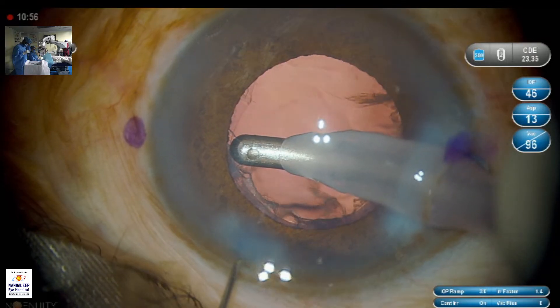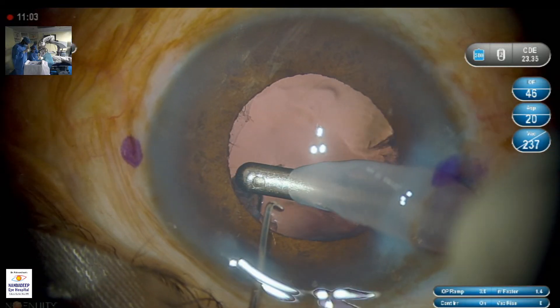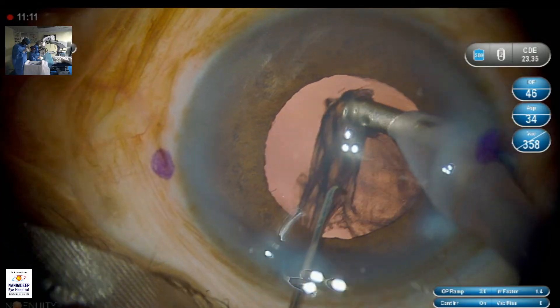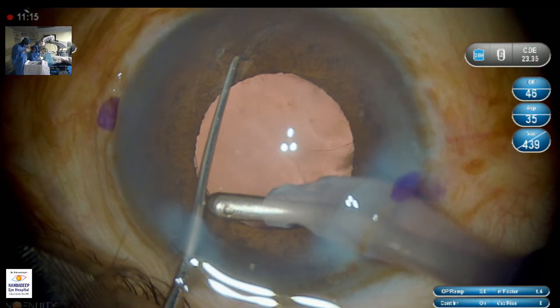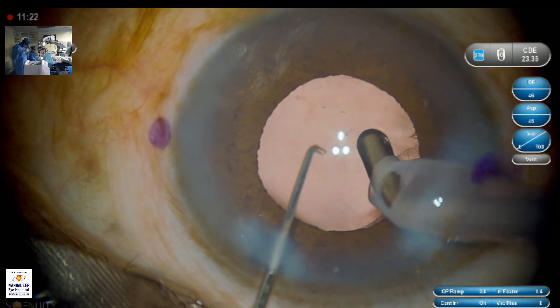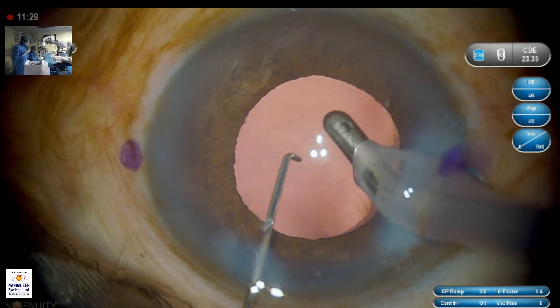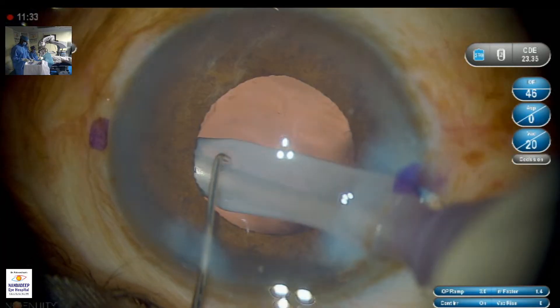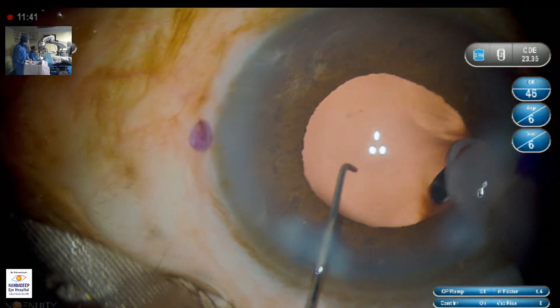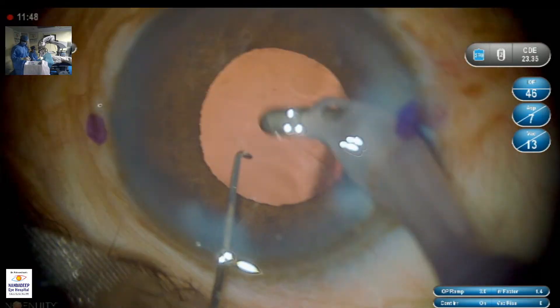A coaxial system is being used for cortex aspiration. The benefit of this system is that the sleeve can deliver more fluid and the chamber is more stable compared to a bimanual or synchro system. You can notice that the surgeon is going under the rhexis margin, grabbing the cortex, bringing it to the centre and pressing full flow. A low-settings posterior capsule polish is being done with settings of 20 mmHg vacuum and 10 ml per minute flow.